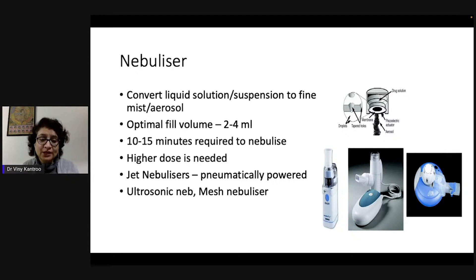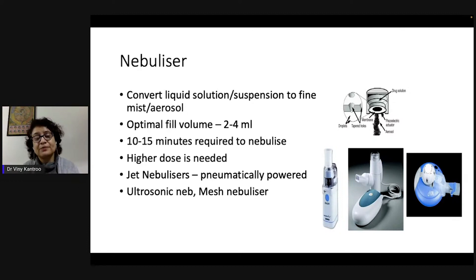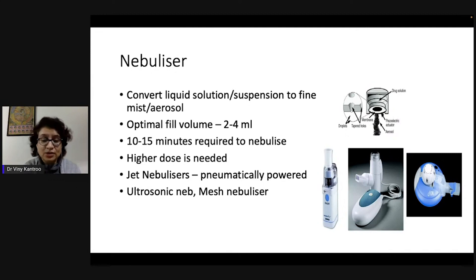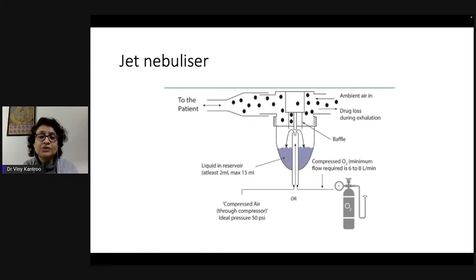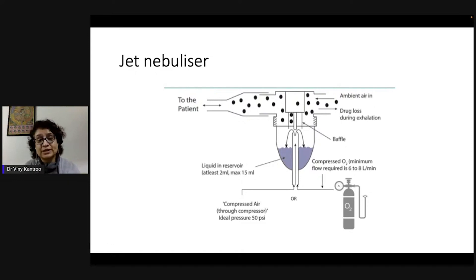Jet nebulizers are pneumatically powered and represent the conventional larger nebulizer. Ultrasonic and mesh nebulizers use a piezoelectric membrane or region to convert liquid into aerosolized form. Various handheld nebulizers are also available today. This pictorial graphic shows how liquid is converted into aerosol in a jet nebulizer, which makes a lot of noise when connected to electricity.